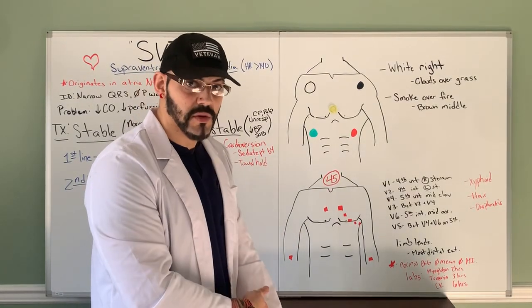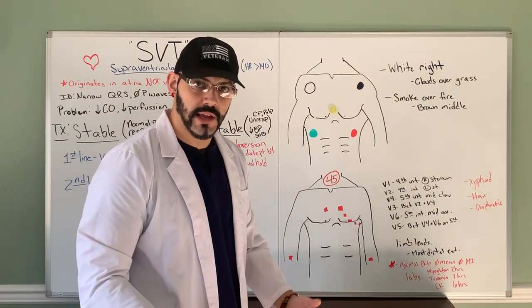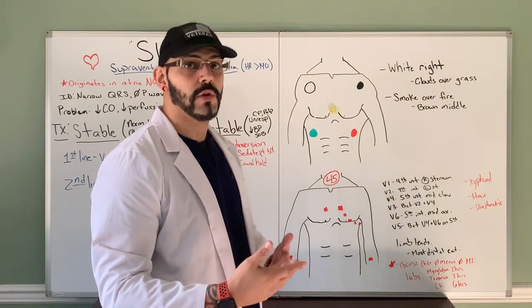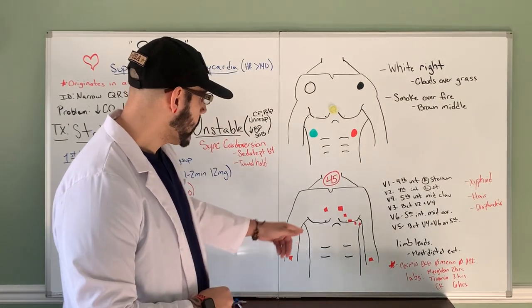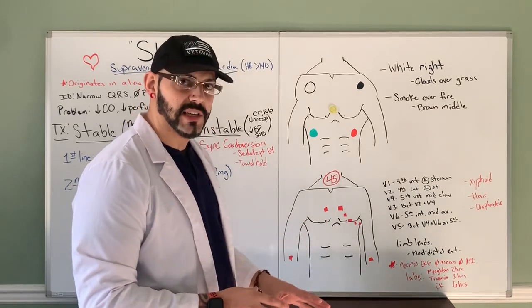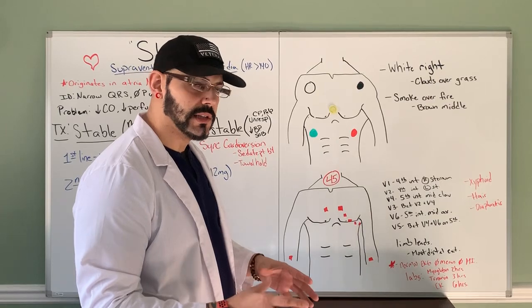If they don't have that extremity, we'll just go to the shoulder or go to the femoral area, things like that, okay? But try to put it in the most distal part of that extremity or where the extremity would be, all right? 45 is the magic number I want you to remember here when thinking about EKG placement. 45. As long as you remember that, everything else should come relatively easy, all right?